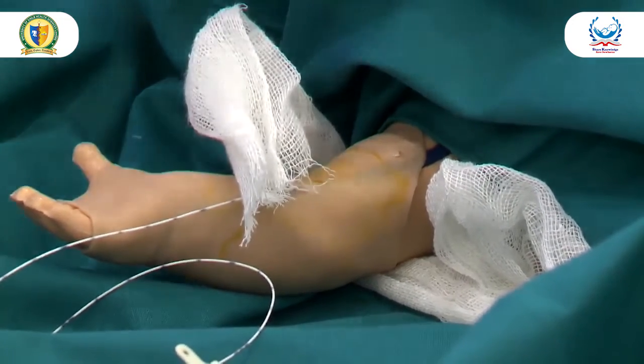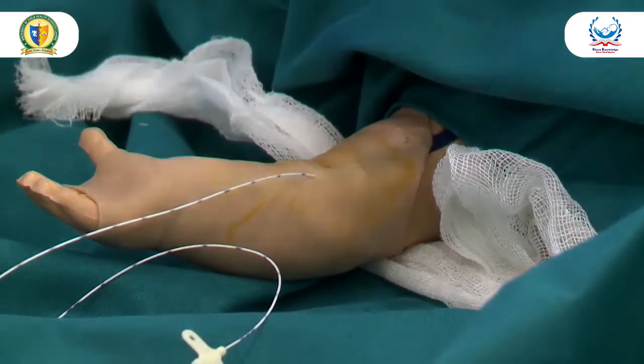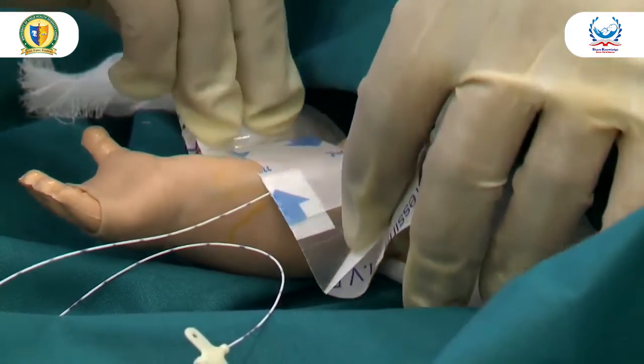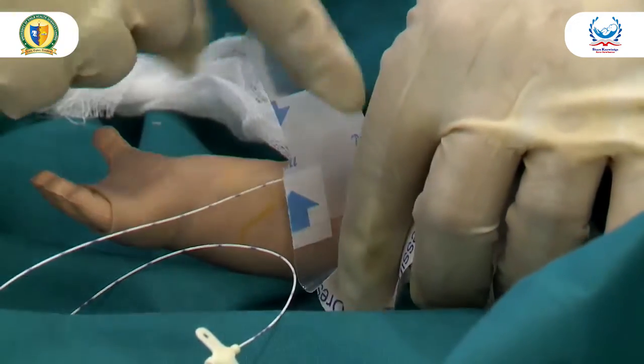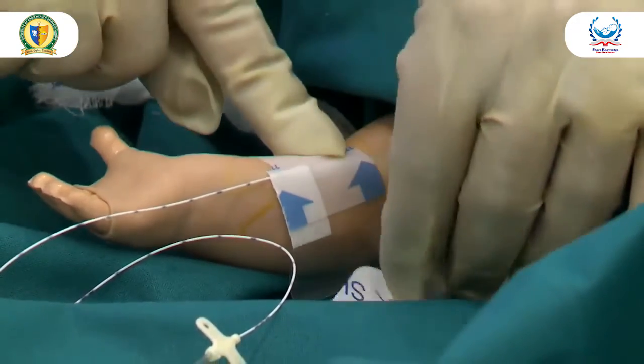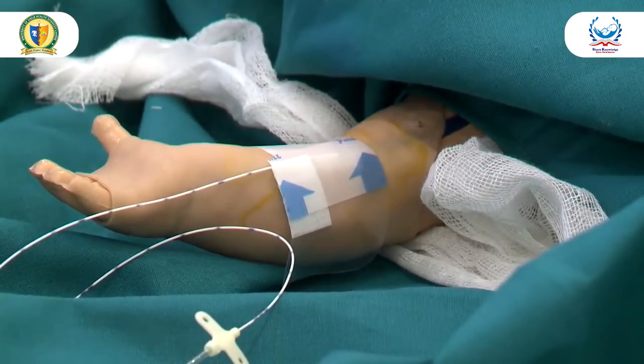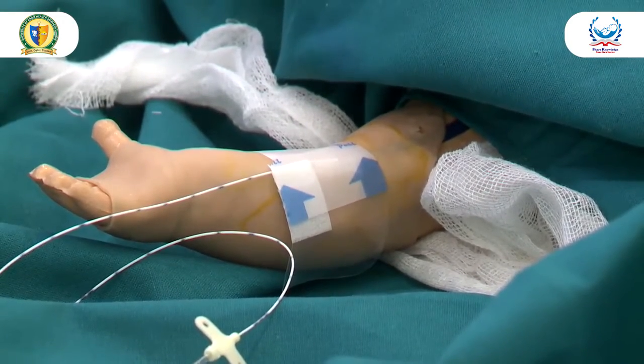This is very important. We don't have the sterile strip, so just think that this is the sterile strip. We would put it like this and leave it until the technician comes and does the X-ray for us, and we confirm the position, and then do the dressing.